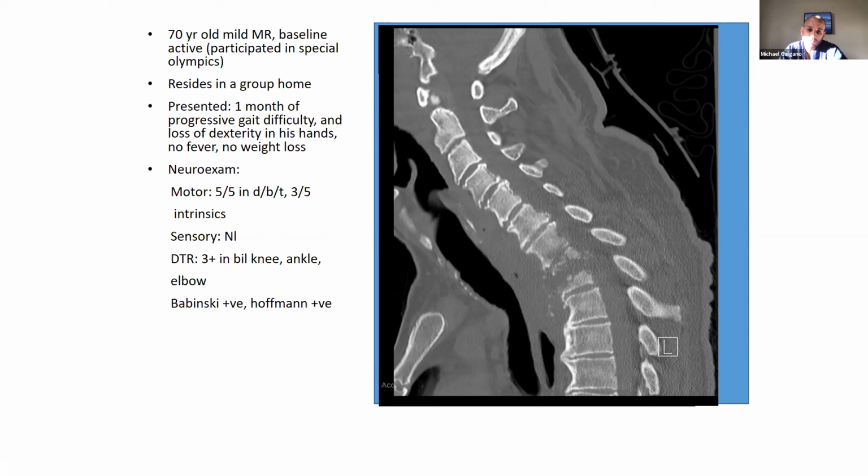Can you do this from the front? Possibly. It looks like the manubrium is at the level of T3, so it might be your lucky day. Maybe you could sneak something in from the front and then fix them from the back as well. So that's a possibility as well. Okay, great thoughts.